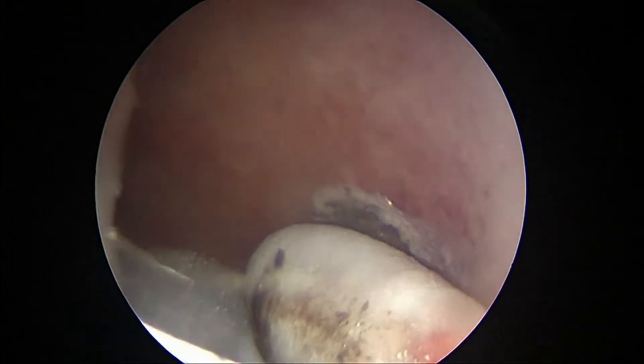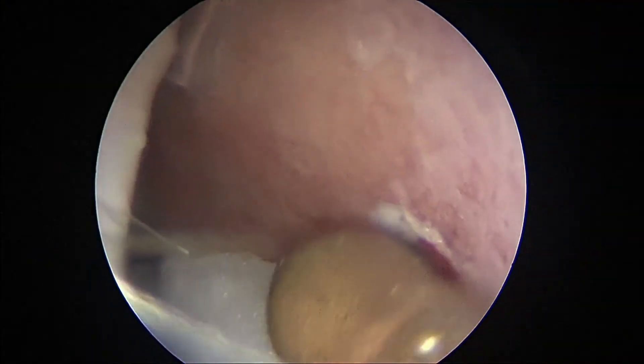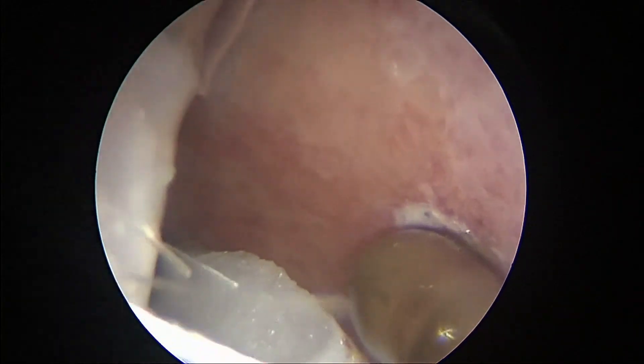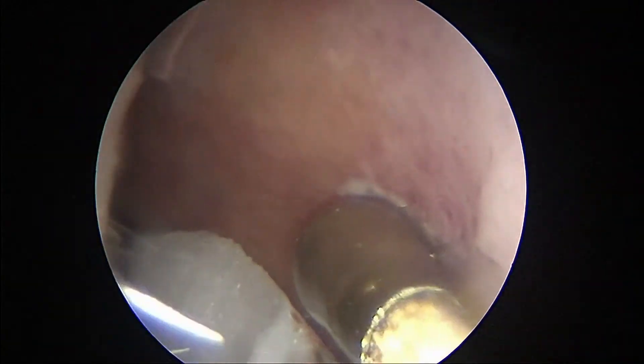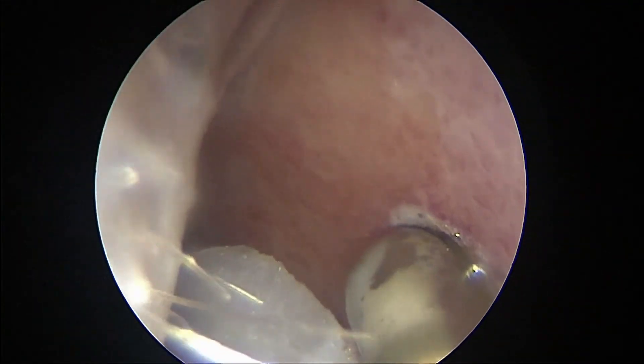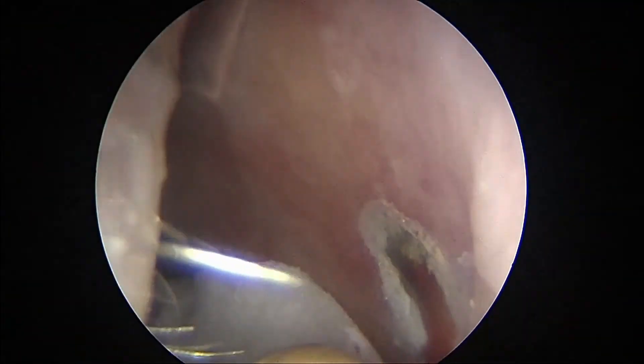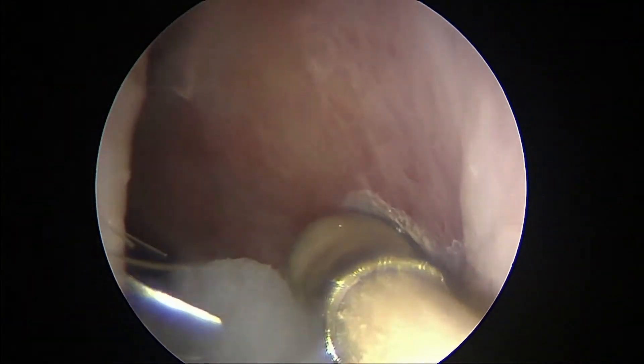You may still notice that it is friable or it may bleed again. I'll often do a second application — here we do another silver nitrate stick to apply some fresh silver nitrate. Still a little bit oozy, and again, the more important thing is that second Q-tip on this area. It holds that silver nitrate on while it's working, and I've got that area bleeding one more time.